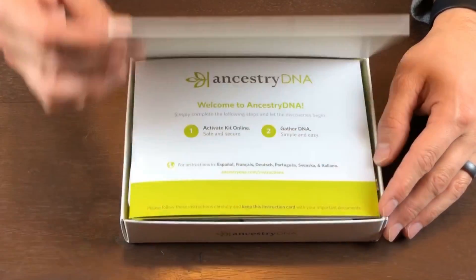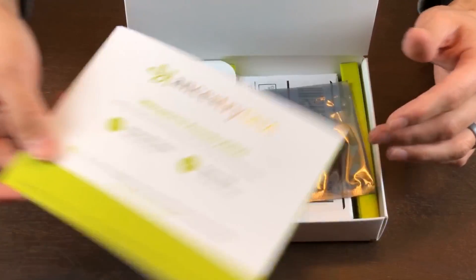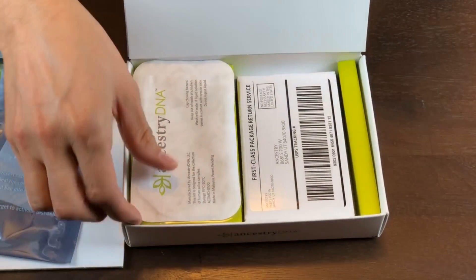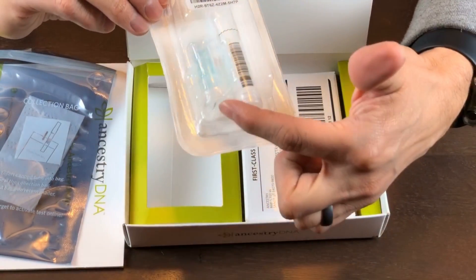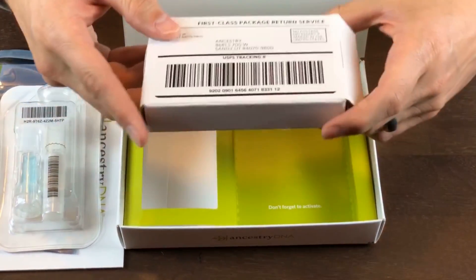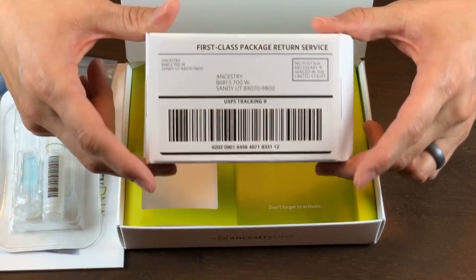Here's everything that's going to come in the Ancestry DNA test kit. First thing you're going to have are the instructions. You're going to have your collection bag. You're going to have the collection tube along with the blue solution. And lastly you're going to have a small box so you can mail out your DNA test kit.